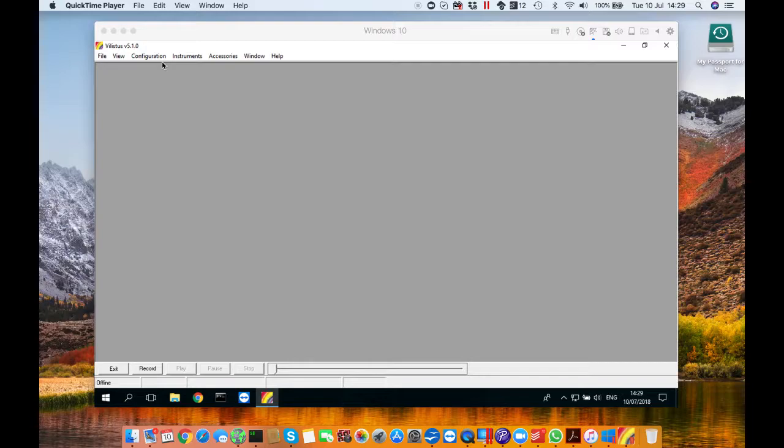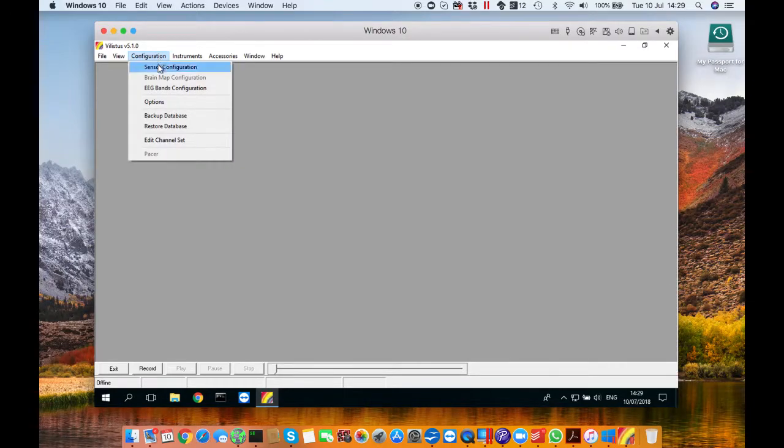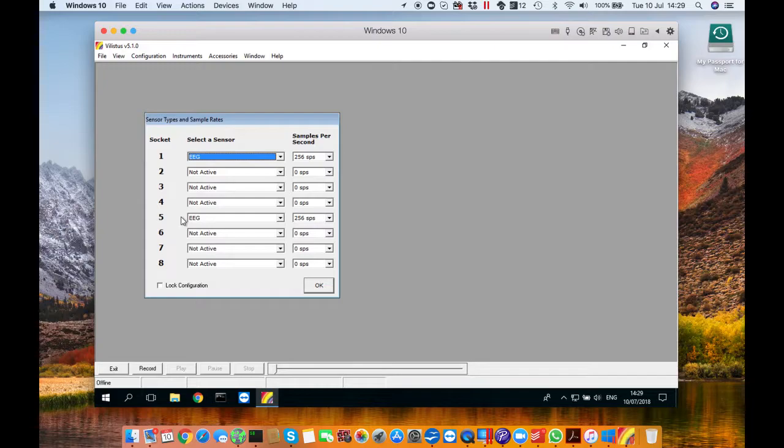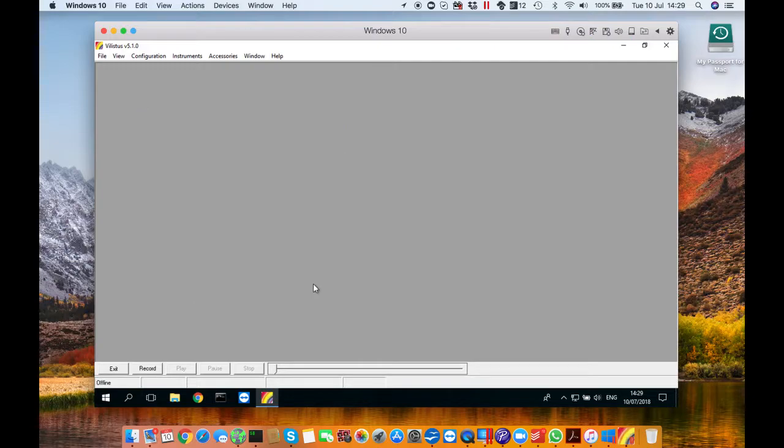So let's get started. First you need to configure your sensor. Go to configuration then sensor configuration and this window will pop up. You need to make sure that socket one and five has EEG selected for the selector sensor. The rest should not be active. And then with the samples per second it should be 256 SPS. Once that's done click OK.